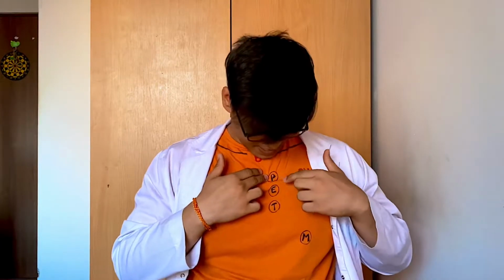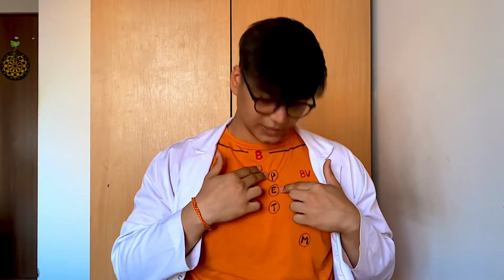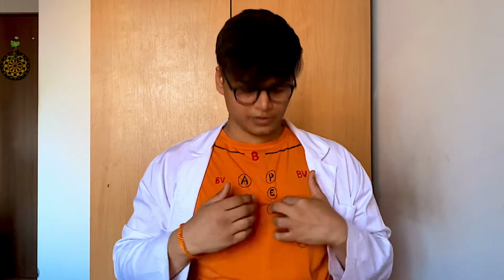So on the right border of my sternum at the second intercostal space is the auscultation point for the aortic valve, and to the left border of the same intercostal space I have the auscultation point for the pulmonary valve. At the third intercostal space on the left border of sternum I have the Erb's point, and below it at the fourth intercostal space at the left border of the sternum I have tricuspid valve auscultation point. For the mitral valve I have to go from the mid clavicular line at the fifth intercostal space. This is my mitral valve.